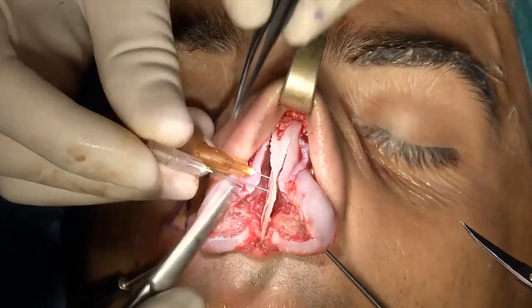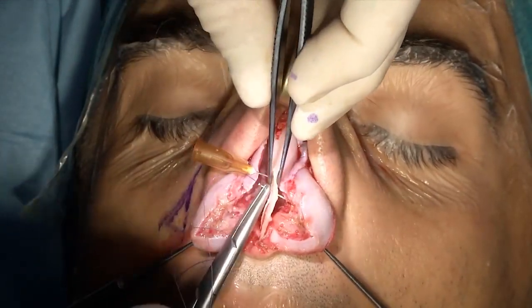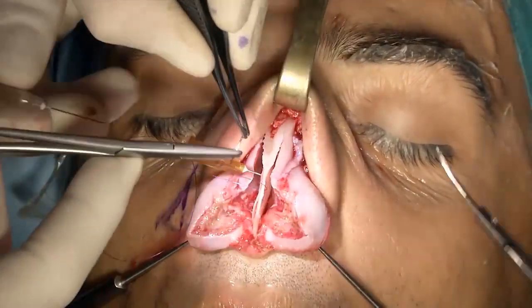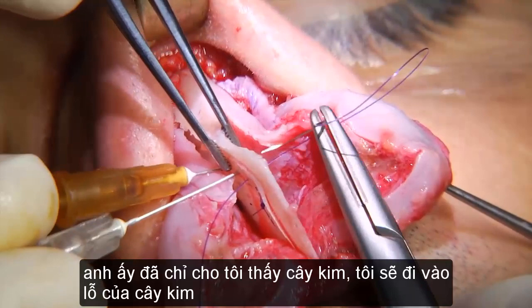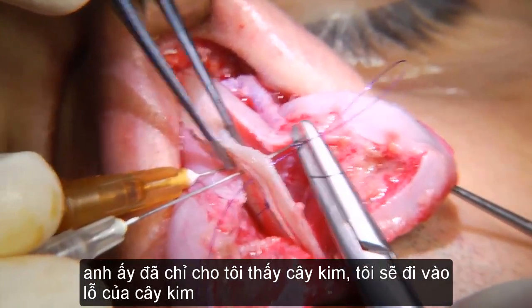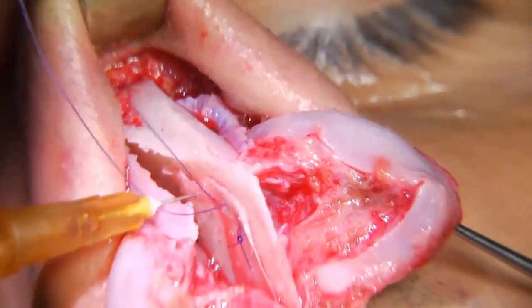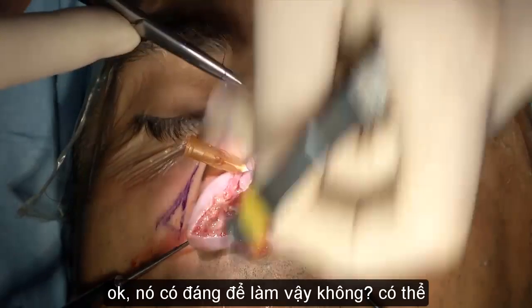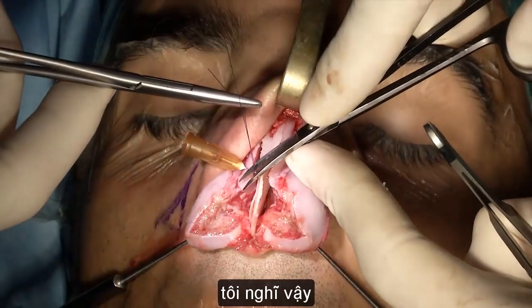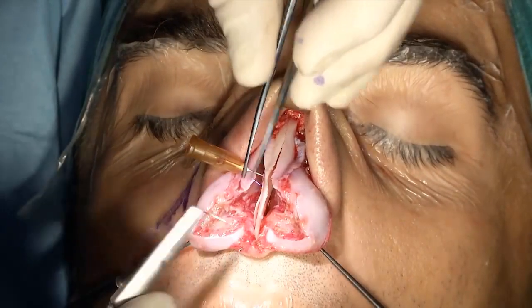Yes, but I can get through. Also coming back? Yes. No. Okay. Bring it closer, but choose the right one. This one. That one? That one there, come on. This one is good? Okay. So he's showing me the needle, I'm getting in the needle, and I'm coming out. So I use the needle as a guide. Still needed. All right, so is it worth doing this? Maybe. I think so. Be careful though. Otherwise I wouldn't do it.